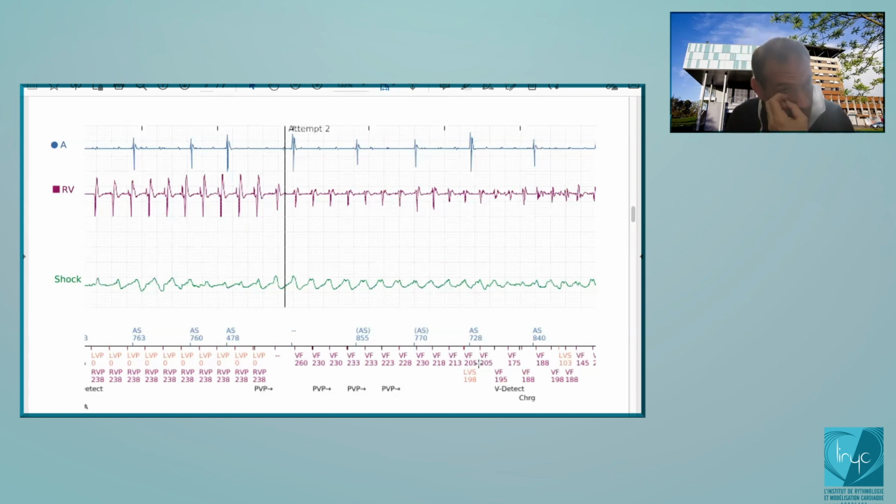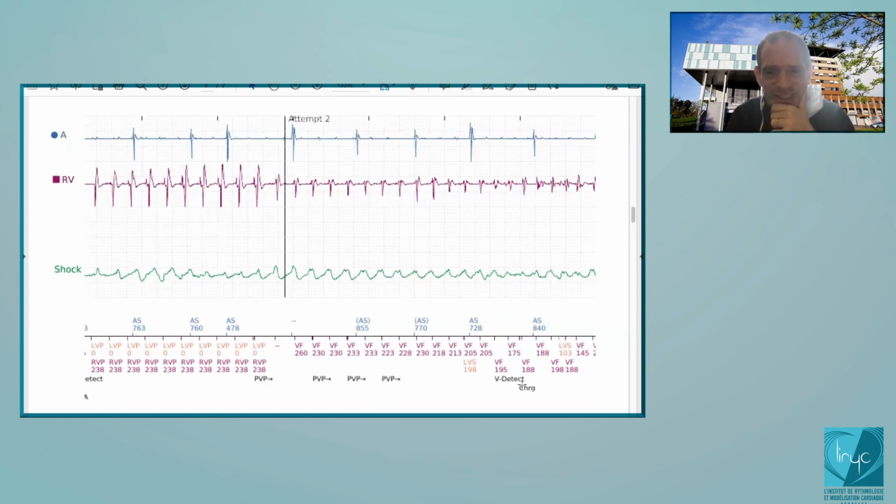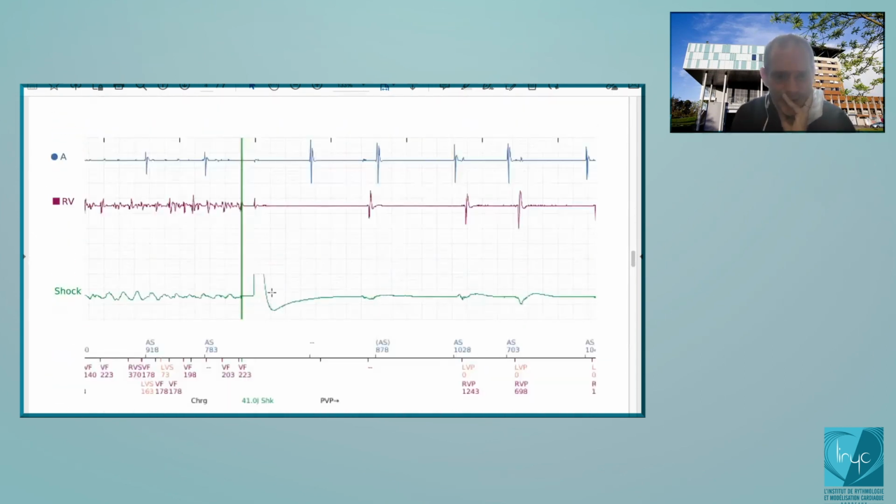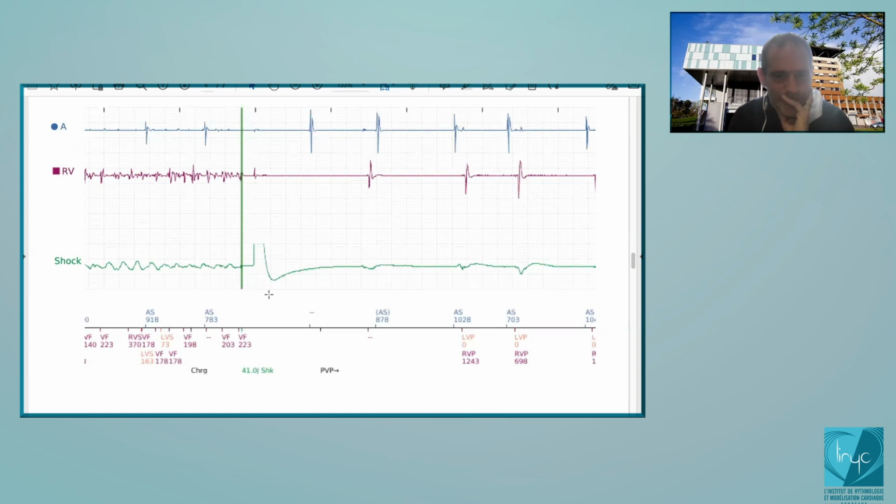The idea is not to prolong it too much before the charge of the capacitor if there is an acceleration. You do not consider that here it's an initial diagnosis of ventricular fibrillation. It's a post-therapy duration that is used, and it is 1 second non-programmable. So you will charge the capacitor and then at the end deliver the shock and reduce the arrhythmia. That's clear? Yeah, all clear.